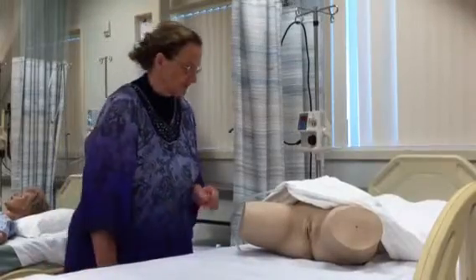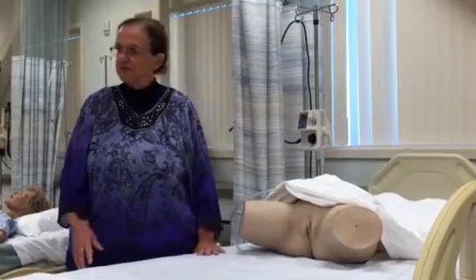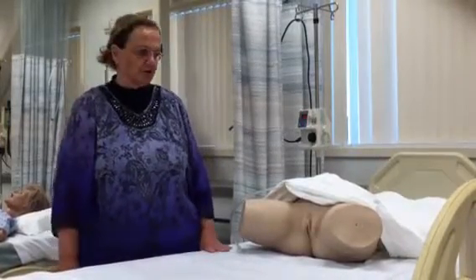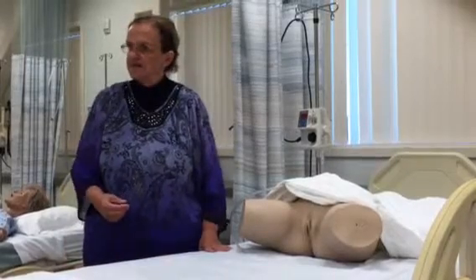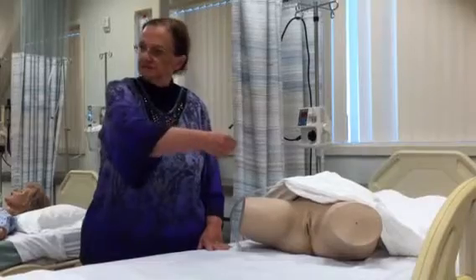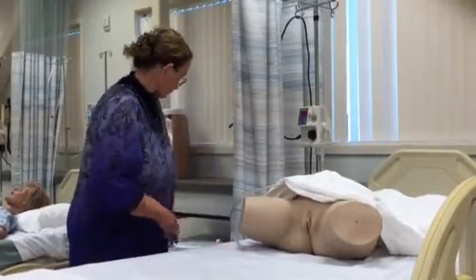So from that perspective, I want you to notice that I've draped my patient. I've also put the bed at a comfortable level for me, and I happen to be right-handed, so I always like to be on the side of the bed where I can cath the person with my right hand in a convenient spot for me. So I intentionally place it that way.